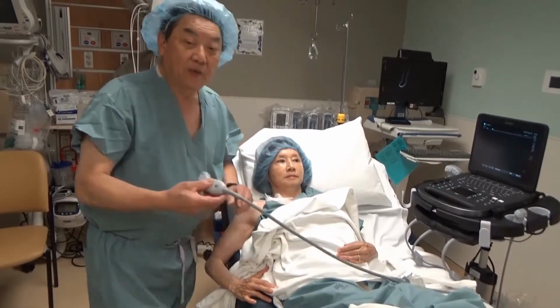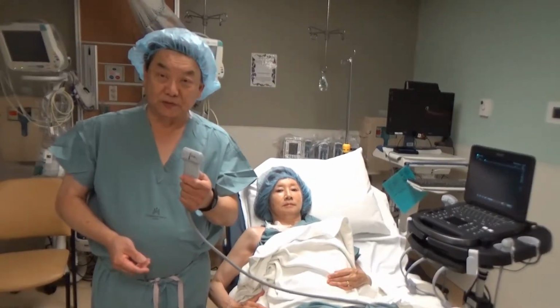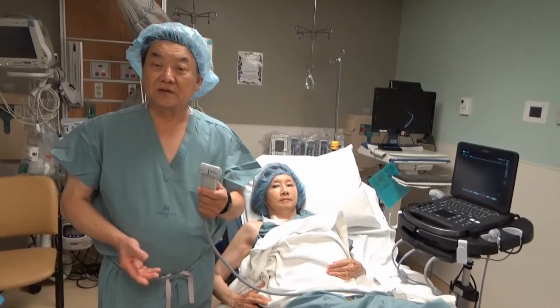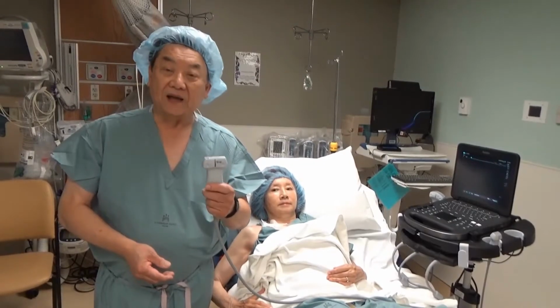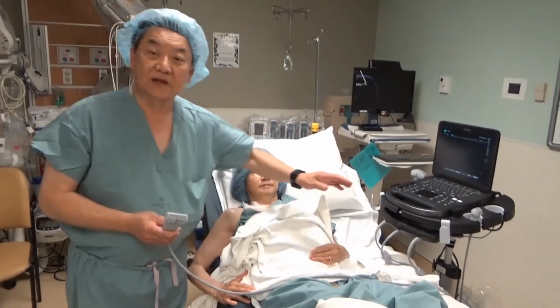And I will be scanning her with a linear array transducer. Usually we use about 10 to 12 megahertz, again depending on the size of your patient. Linda fortunately is very thin, so we're going to have a higher frequency transducer. And over here we have our ultrasound machine.